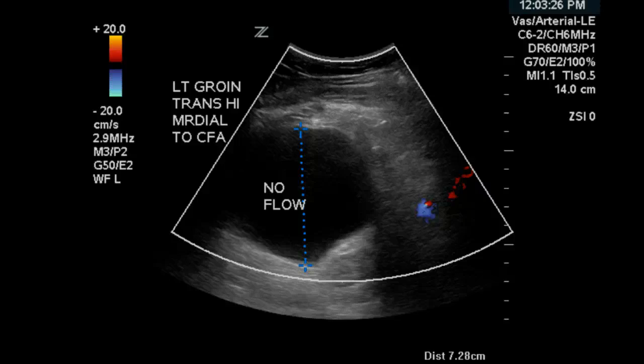Here we have a patient that presented with pain and a lump at the left groin. The sonographer images the groin area and finds a large anechoic mass that appears to be avascular. I say 'appears' because in this first picture, the sonographer has employed color Doppler and we do not see any flow.